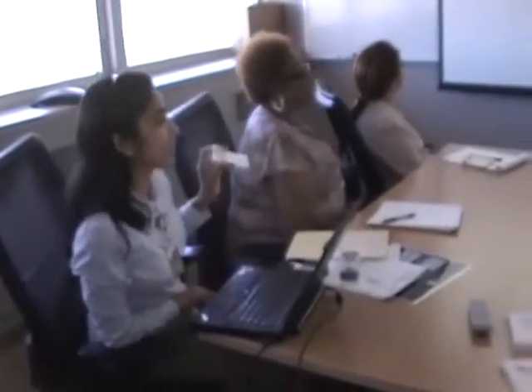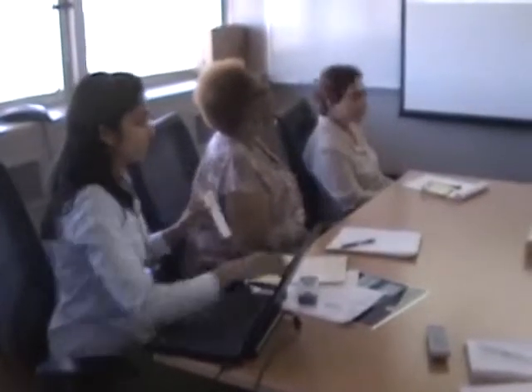So second step is scanning your patient's armband, and make sure you always check 2 patient identifiers. So what are the 2 patient identifiers you will check? Name and date of birth. Yes, name and date of birth. So I have this BCMA test 3 patient, and he's born on 9/6/1973. So always make sure it is the right patient. So now I'm going to scan the barcode on this patient's armband, and it straight away takes you to that medication administration record.